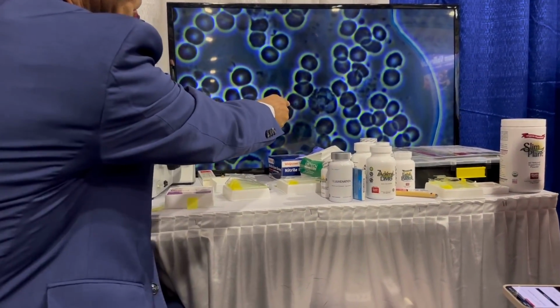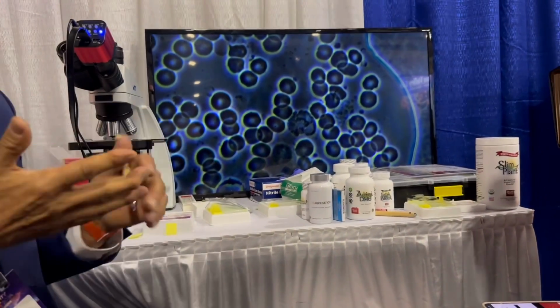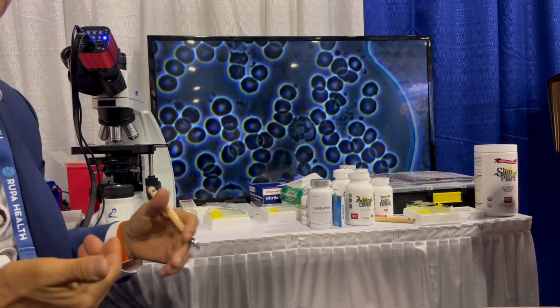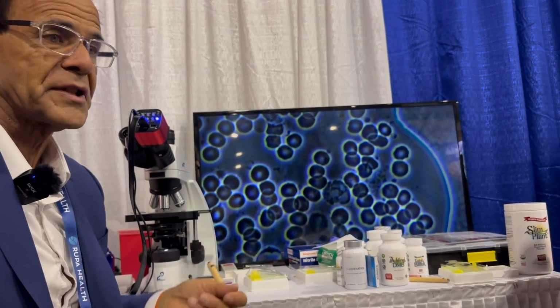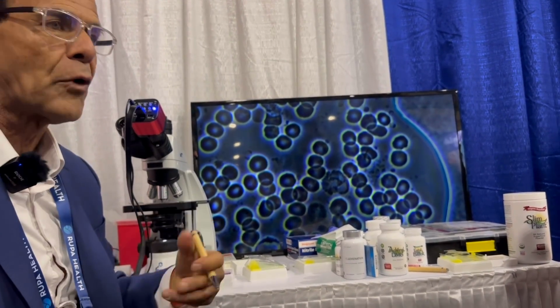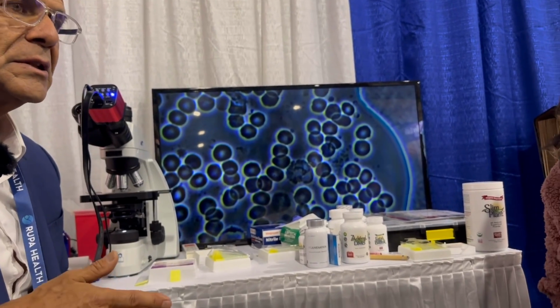Another white cell. Remember, there should be only one white blood cell for every 500. She's got 1 or 2 per 50, right? So with the white cells, your body is either fighting something, or it might be normal for you. When you get a cold or sick, do you rarely get sick and get over it quickly, or when you get sick, does it last quite a while?